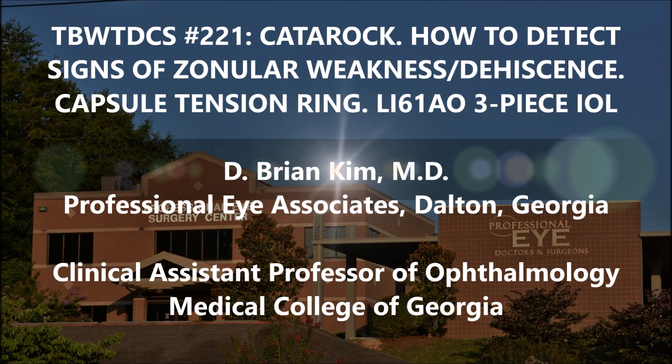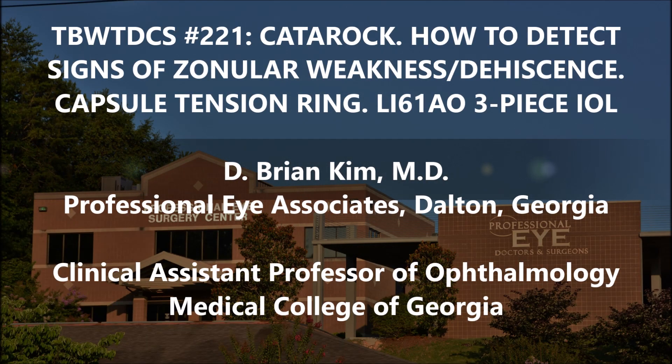Hi, this is Brian Kim. I'm going to share with you case number 221 in the best way to do cataract surgery series. This is a cataract and you're going to see areas of zonular dehiscence throughout the case. I want to pause the video and show you the areas of zonular weakness, and then I'm going to place a capsular tension ring and then a three-piece lens. This is the LI-61AO lens, which we've been trialing most recently.